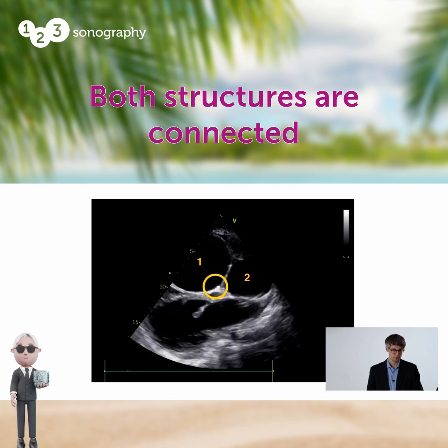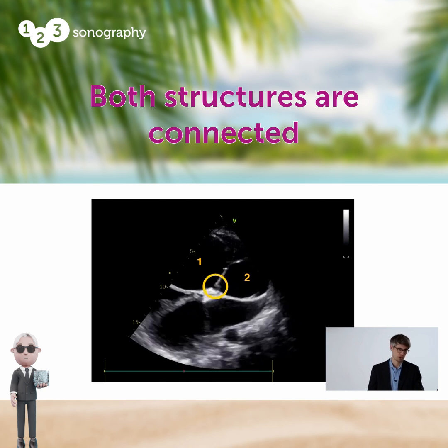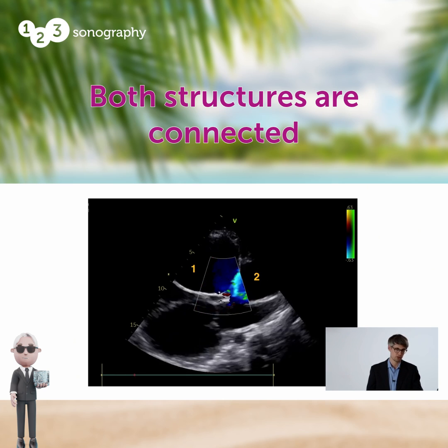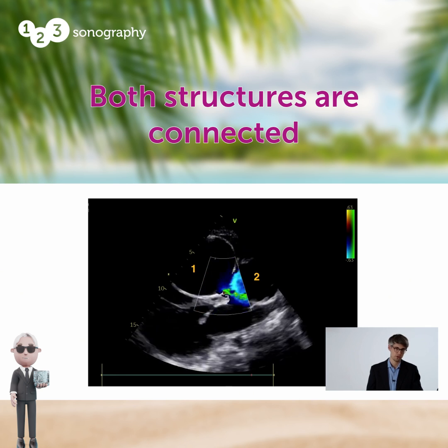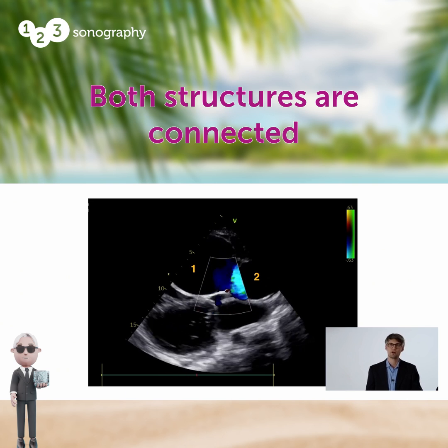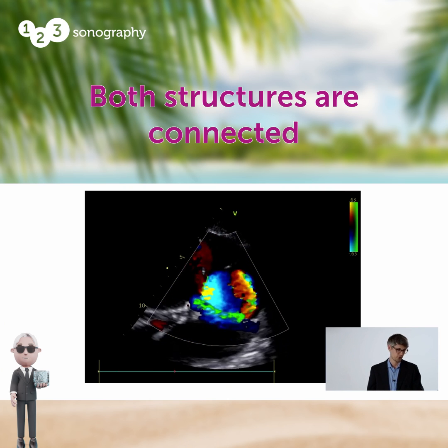Here is an off-axis long-axis view, and I numbered the chambers: one is the chamber sitting on top of the aorta, and two is the chamber in the right atrium. I circled that there is actually a connection between the two. With color Doppler, you can see flow going from one to two — from the large structure into the small structure in the right atrium. And again you can see this turbulent high-velocity flow going from the large chamber one into the small chamber two.